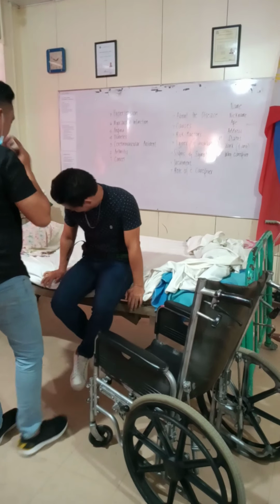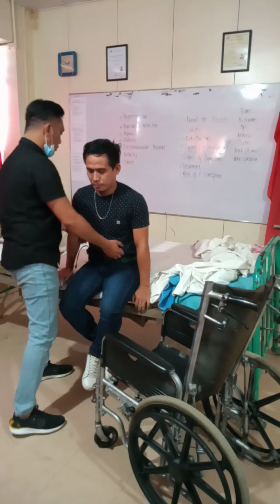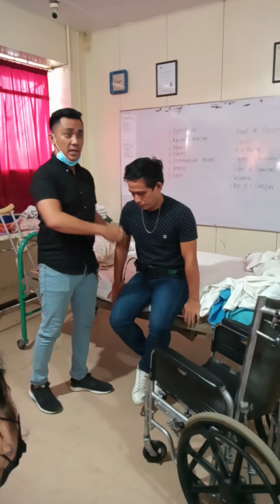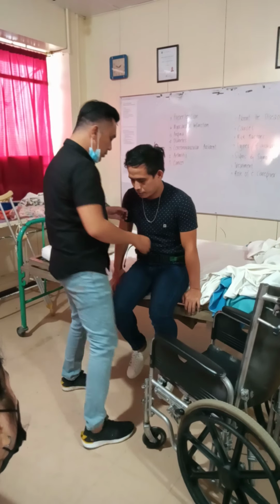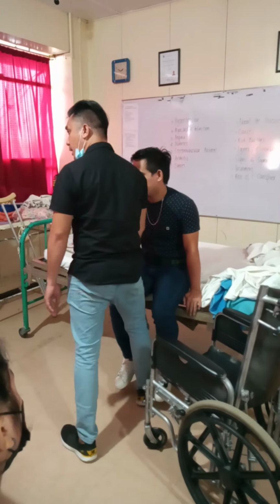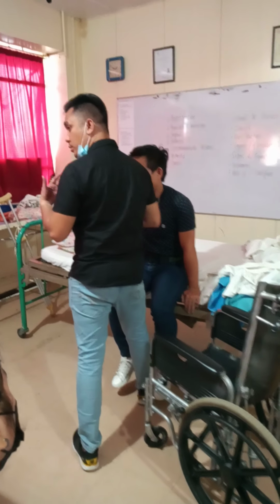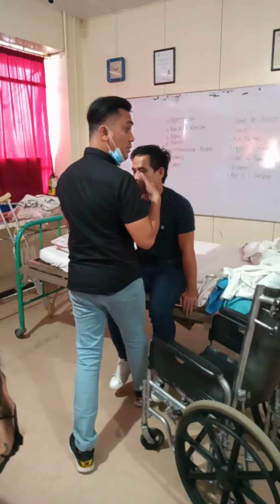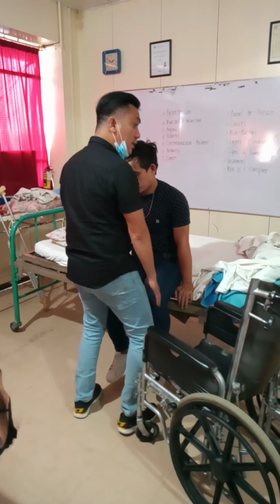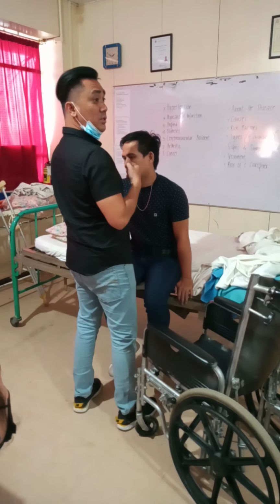Alright. Okay. Next is pabarugo na to si patient. Now, our role is to make sure na makabarog si patient stand straight kina siya using the gait belt. Okay? So how do we do that? There are different types of position. It could be in between sa iyang legs na ato ko sa kaleg. And the other leg is nasa luyo for base of support para dili matumba si patient o si caregiver. The other position is pwede mo mag knee to knee. Ana, knee to knee and toe to toes para ligbaro ka na niya straight dita.